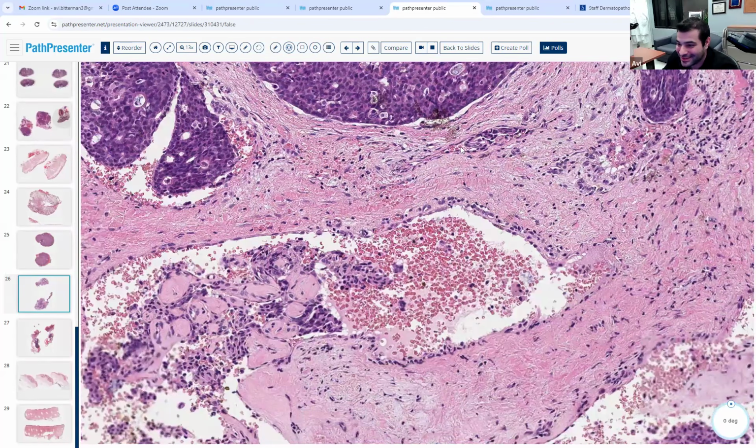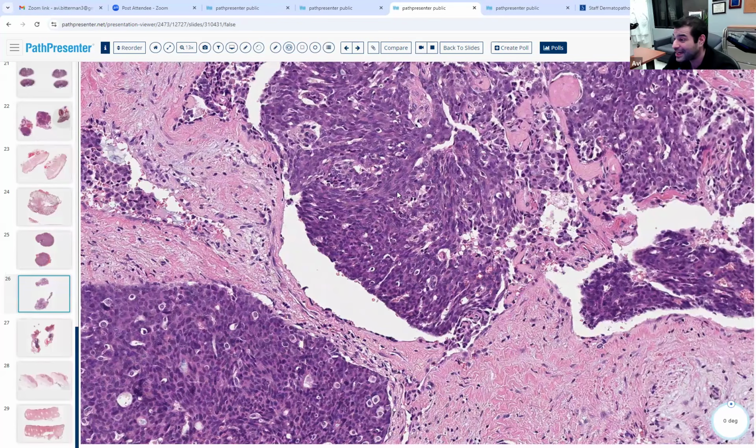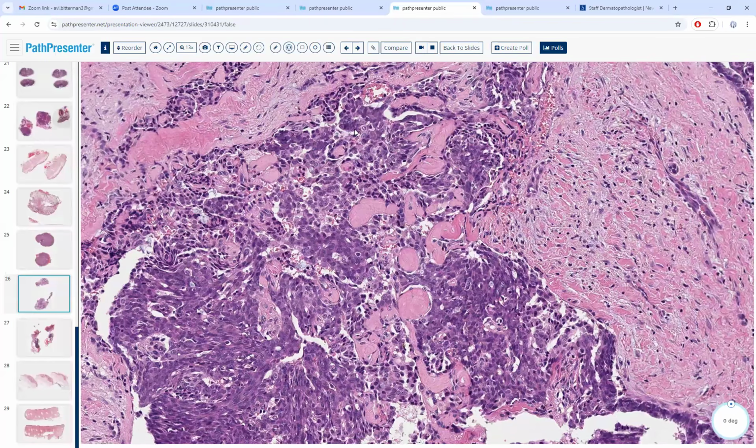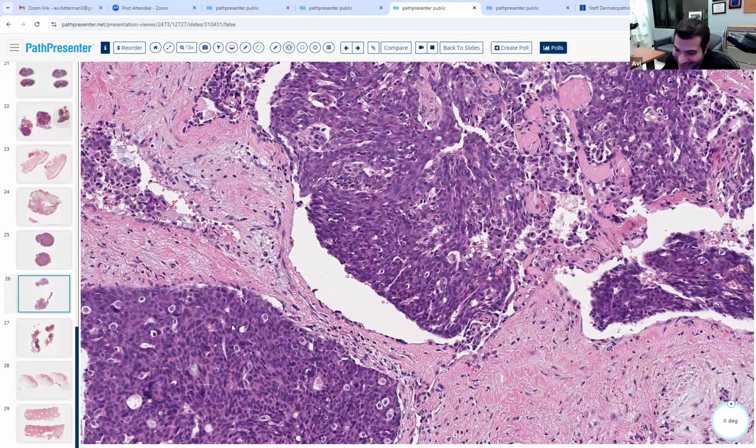Any ideas? You might have seen it already. This is also an EMP-SGC. Yes.